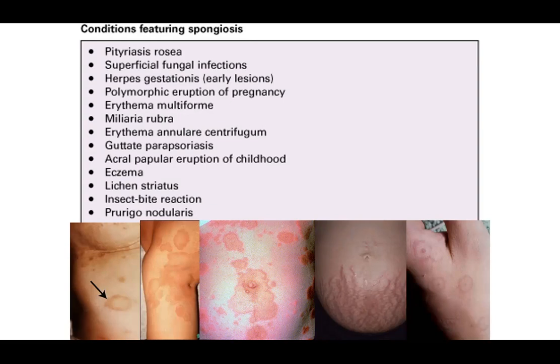It's rather a paucicellular, vacuolar interface dermatitis with necrosis as you go from the outer edge to the inner edge. So this would contain more epidermal necrosis in the dusky center. And as you go out, you're going to find more intact epidermis, but you're still going to see some interface change.